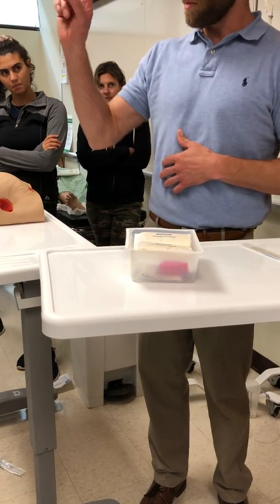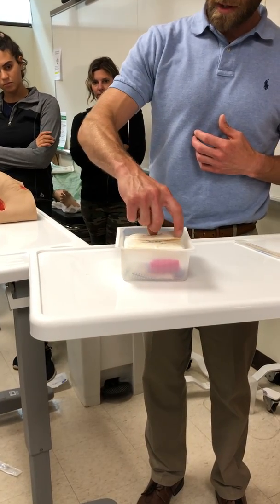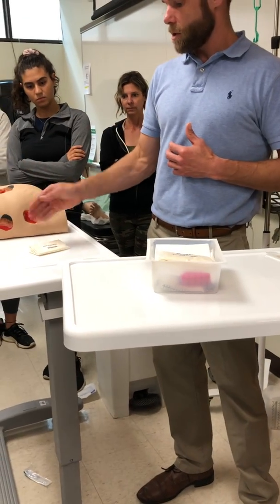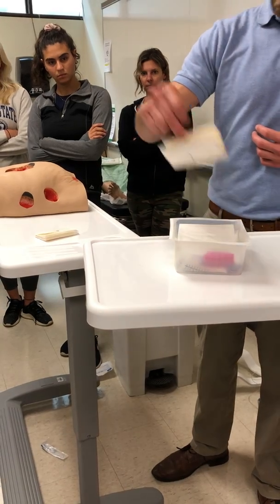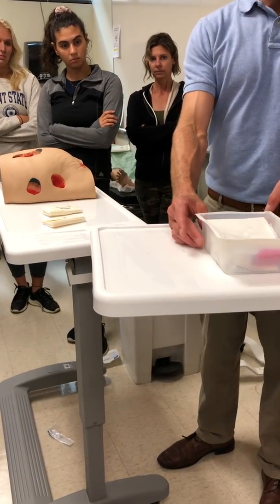I can do this entire thing with one pair of sterile gloves, but I'm not going to show it to you that way. But it is possible. Okay. So when I do that, students always get confused. So grab it like that. The outside of this package does not need to stay sterile. Do you agree it's not sterile? Yeah. Gloves are still sterile. And I was able to grab them without touching anything else that's there. Is it okay with that?